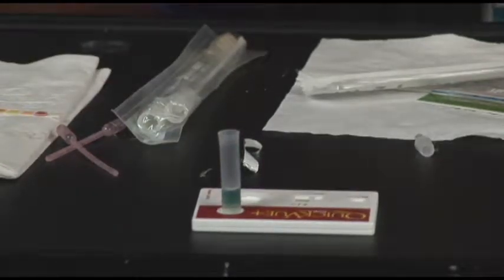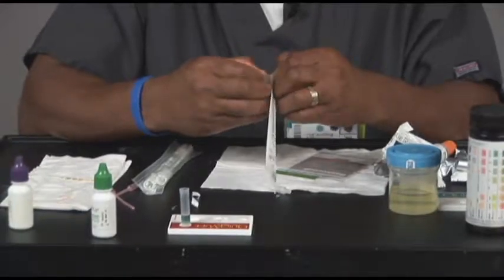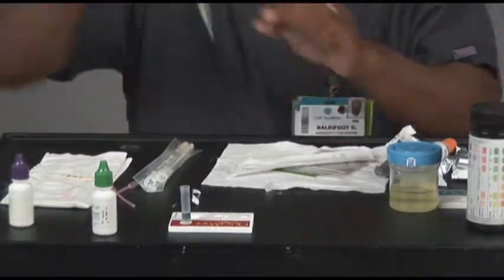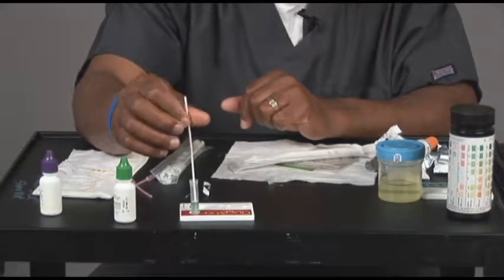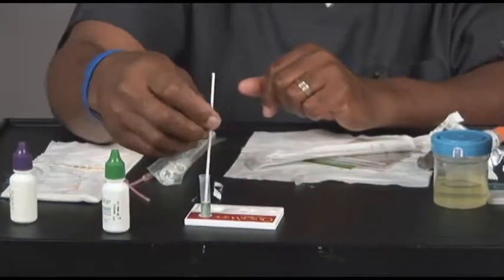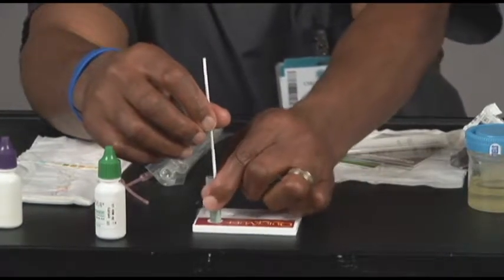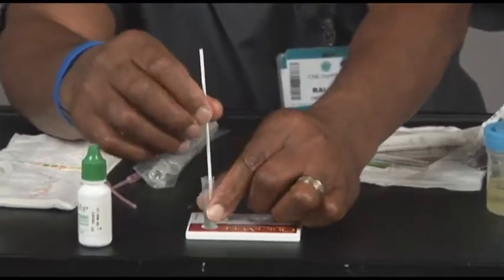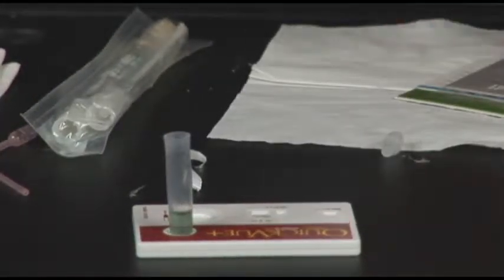And it should turn green, and it should not smoke or anything like that. Next, you would swab the patient's throat, which I'm not going to do myself. Once you swab the throat, you put the swab in here, twist it around for about a minute. We'll say it's been a minute. And as you're pulling it out, you want to squeeze the sides of the test tube together to get as much germs as you can out of there and into there.